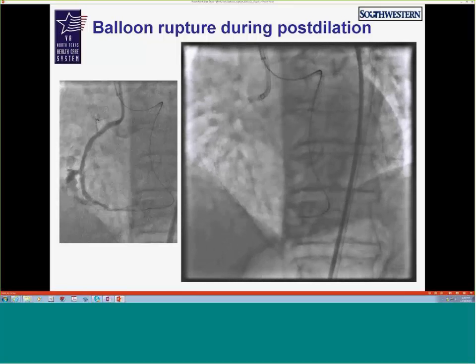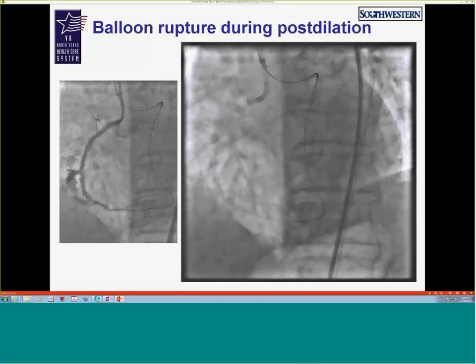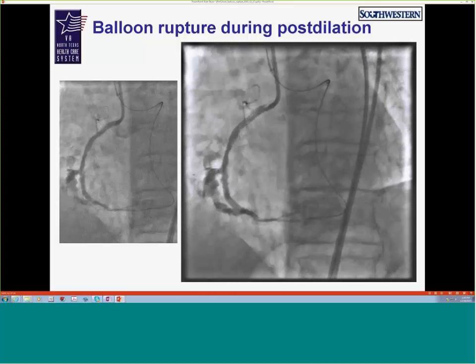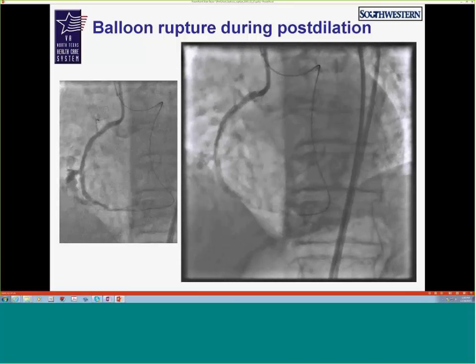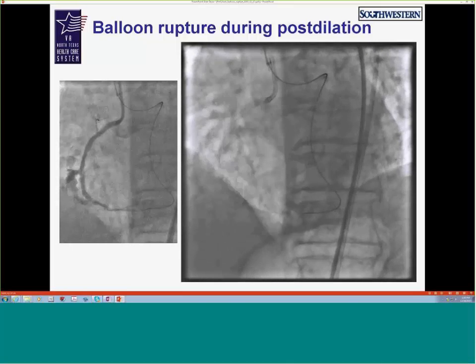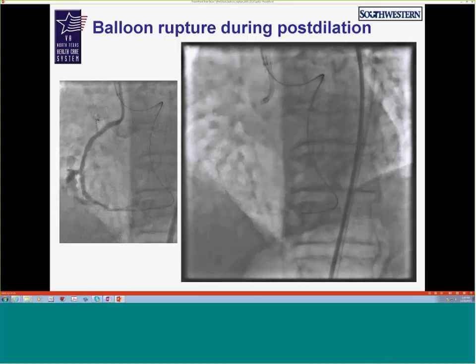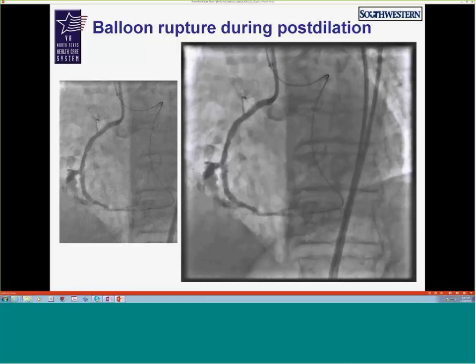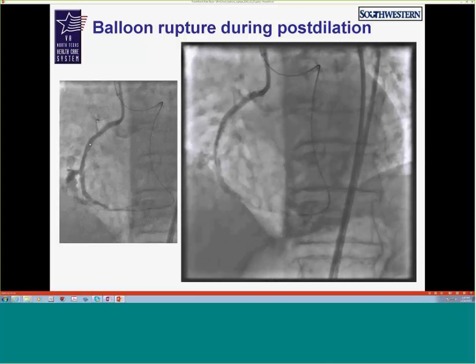I see. So it's hard to know what did it. My theory is that when the balloon ruptured, you get some focal jet of contrast, and this was an area of reverse CART scar, so I think it was weakened to start with. Maybe that's part of the reason why we're having this difficulty, but that's the thought. And you don't think you have gaps there? The whole thing is stented. Everything is stented, all the way from down here up to essentially the ostium of the right.